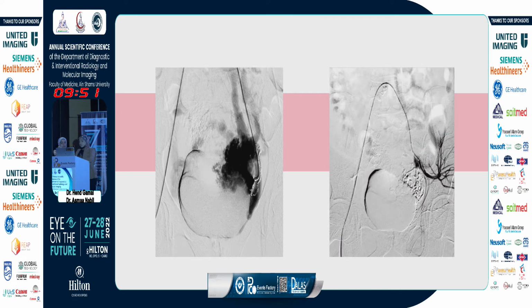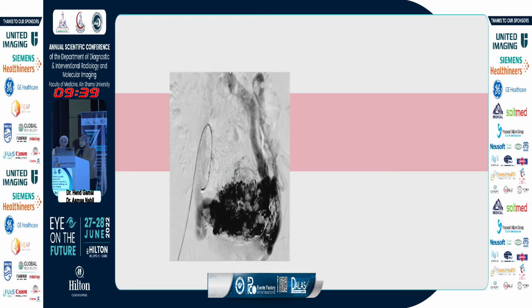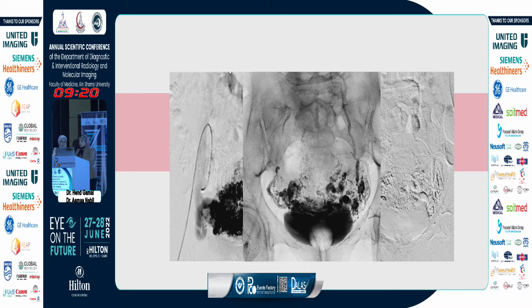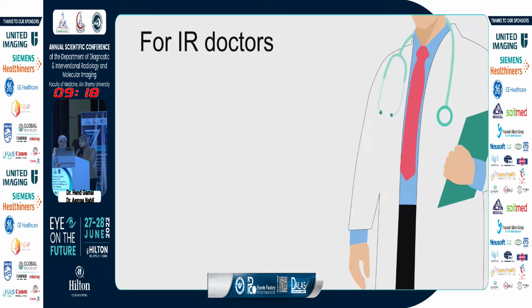Embolization of the left uterine artery was done by a histoacryl-lipiodol mixture 1 to 3. Control angiogram shows no filling of those AVM vessels with preservation of other internal iliac artery branches. Catheterization of the right uterine artery shows another large dominant feeder of the abnormal vascular malformation. Embolization with histoacryl-lipiodol mixture was done, and to the left we can see the control angiogram with complete non-opacification of those vascular channels and glue shown in the non-subtracted image.